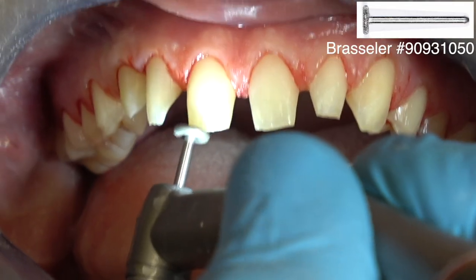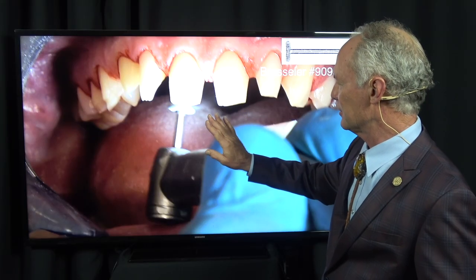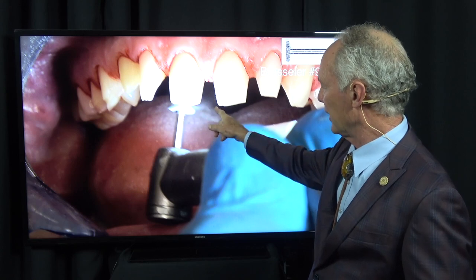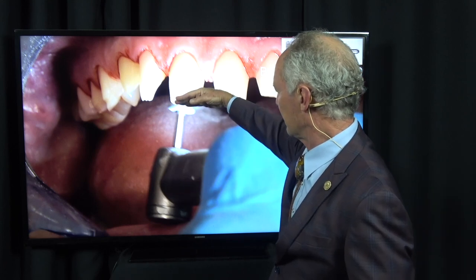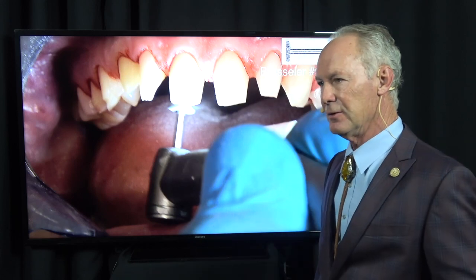So I stand in front with this occlusal reduction burr and prep those incisal edges to be sure they're parallel with the pupillary line. Remember, I want the incisal edges of the cuspids, the lateral incisors, and the central incisors to be flat. By flat, I mean the incisal palatal line angles are 90 degrees. The incisal facial and the interproximal facial line angles are rounded. But I want this to be a flat surface. Don't taco it onto the palatal.